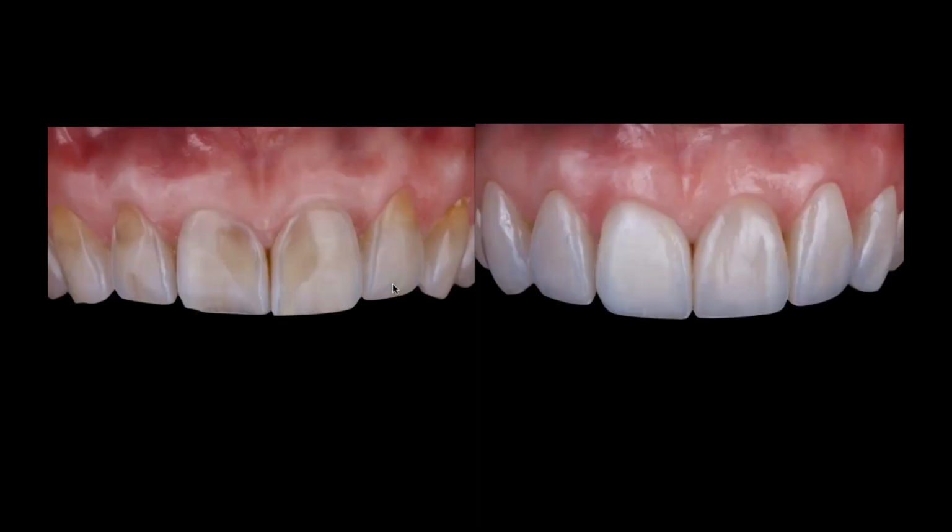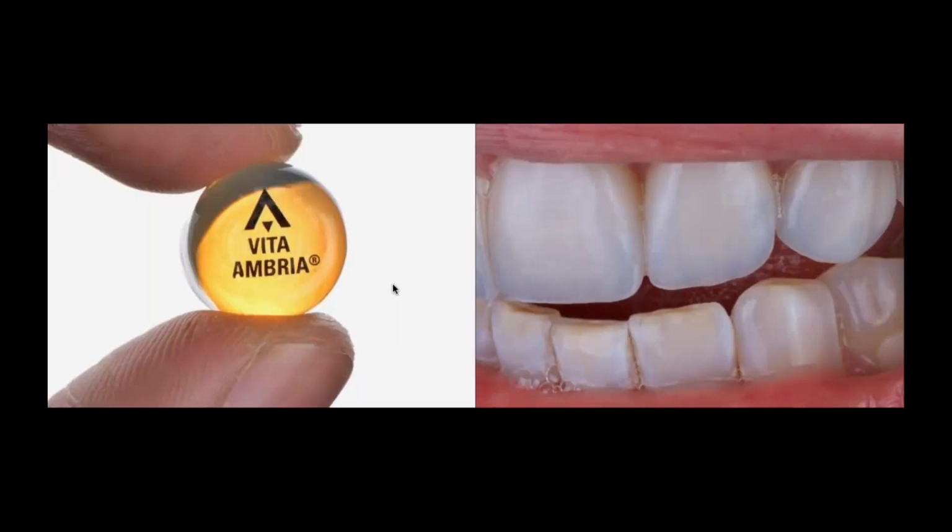So this is the before on the left, this is the final on the right side, and it's really nice to see what we were talking about, this possibility of rejuvenation, enhancing the smile, enhancing the aesthetics on the anterior teeth without having to do a full mouth rehabilitation and going to an extreme bleach or toilet white shade. So these are the type of cases that we really enjoy doing, because we improve the aesthetics, but we keep our focus or our way of doing dentistry in a more conservative approach or manner.